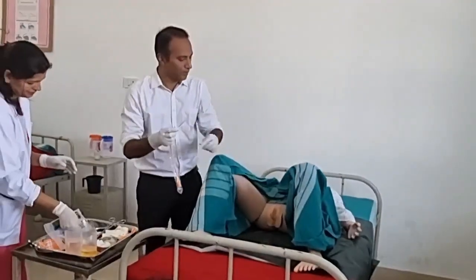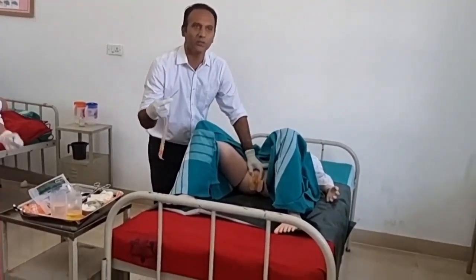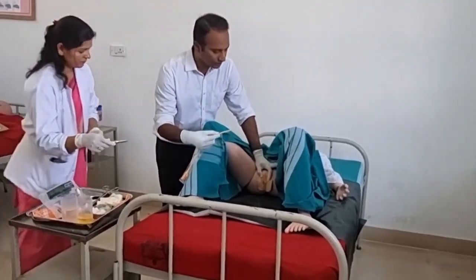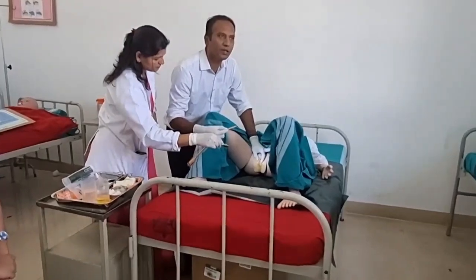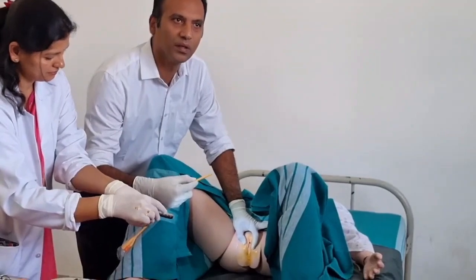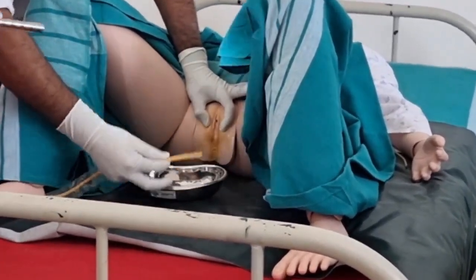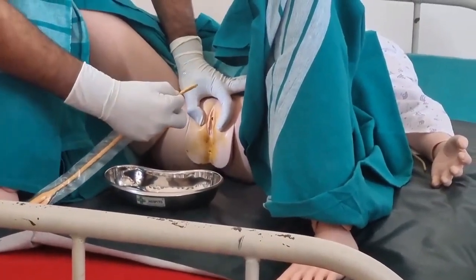Okay, so observe here. I may ask madam to illuminate the area because sometimes it may not be visible. Please. Here, see, you have to differentiate between the vaginal orifice and the external urethral opening or urethral meatus. See, that is the key part here. And we will keep the kidney tray as well because as soon as you insert, the urine will drain out.